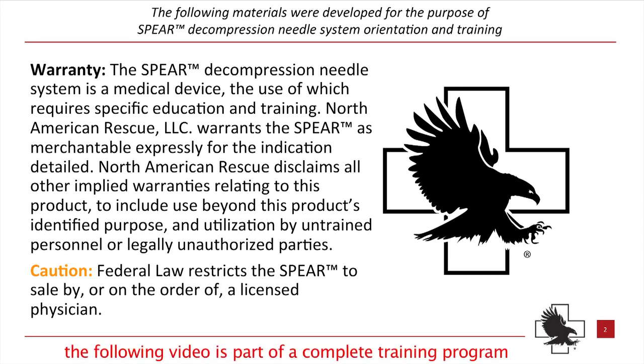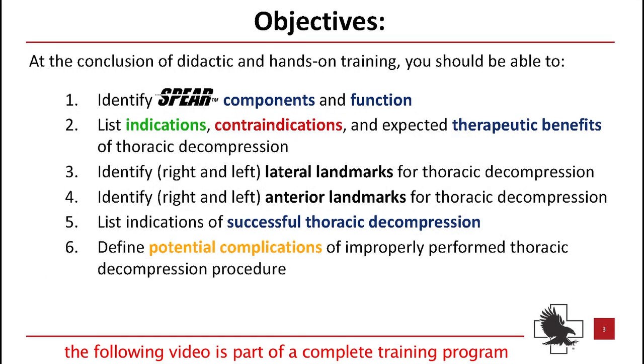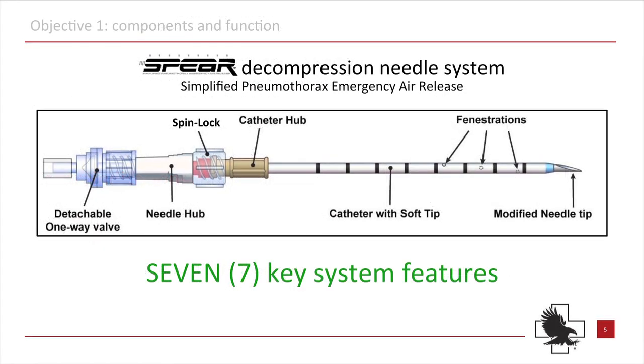The following video is part of a complete training program. Each of these objectives is designed to ensure safe SPEAR usage. Indications, contraindications, and therapeutic benefits are important facets of safe SPEAR usage. Identify 7 key features of the SPEAR Decompression Needle System.